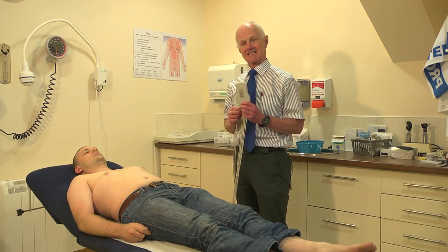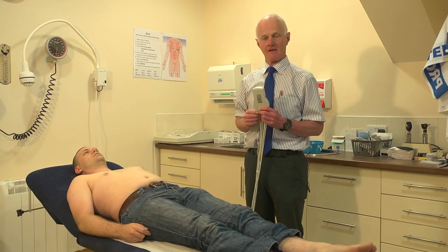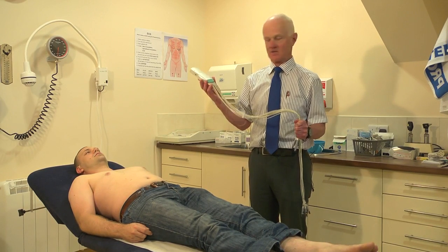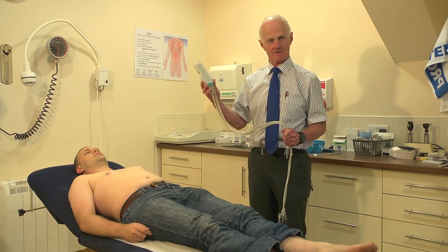There are a few basic rules for taking an ECG when someone who's not used to taking ECGs, like the doctor, has to do it. Number one: everybody in the practice has to know where the device sits so that they can find it easily. I've taken this from the nurse's room — we know exactly where it is at all times, and whoever takes it has to put it back there.